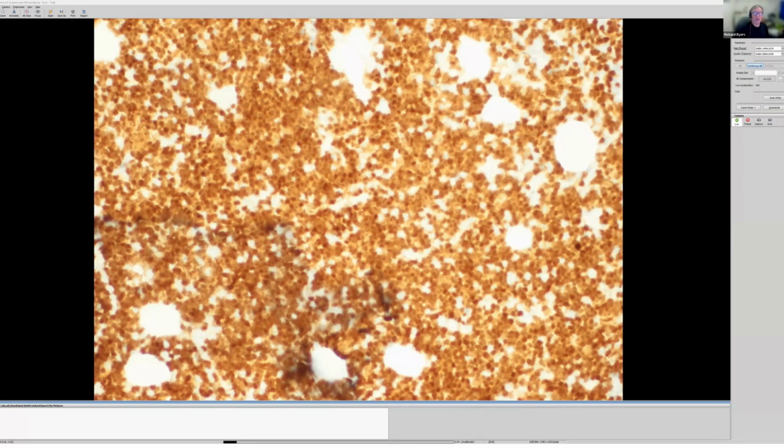It's not a pleomorphic or blastoid variant, because in those all the cells tend to be larger. But characteristically, mantle cell is usually all small cells. In other cases I've seen, if all the cells are small, it's more likely to be mantle. If you've got occasional larger cells, more likely to be CLL. This case, clearly, it's positive. This looks like a mantle cell lymphoma.